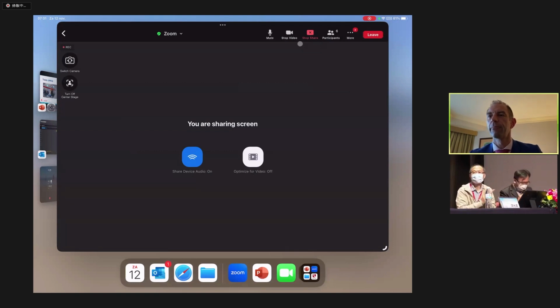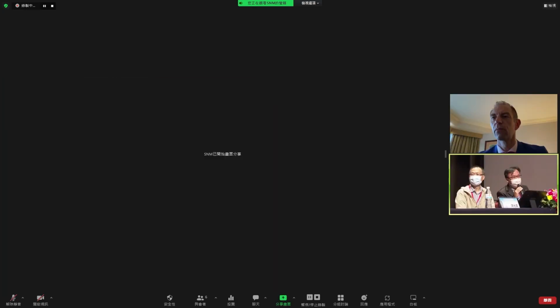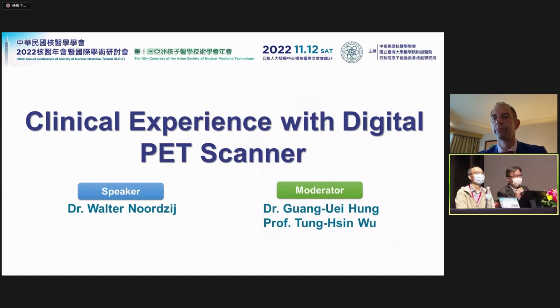Okay, thank you for the nice presentation. Are there any questions from our audience? Okay, I have a short question. As we know, the new modern digital PET should have time of flight technology. So the key parameter is the timing window. I just want to ask, does the digital PET scanner have the ability to adjust or manipulate the timing window, or does it only have one option?